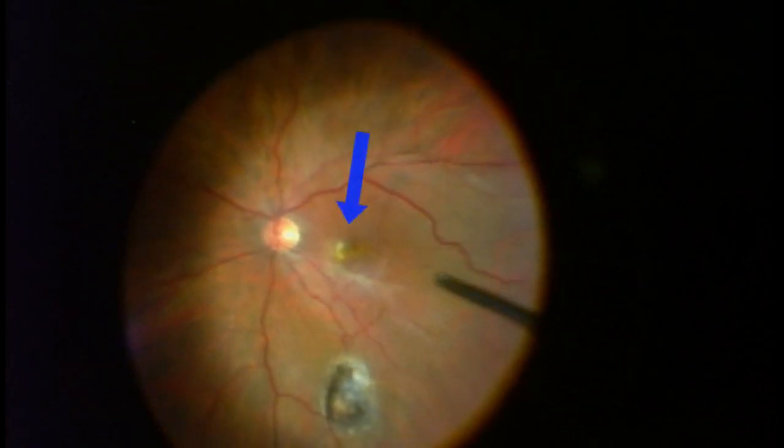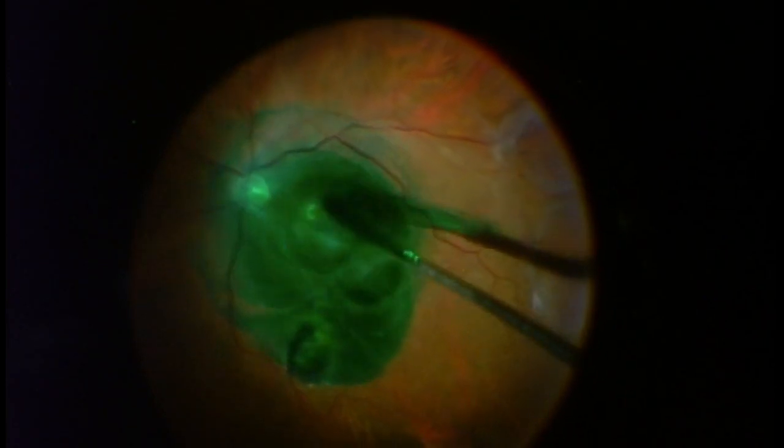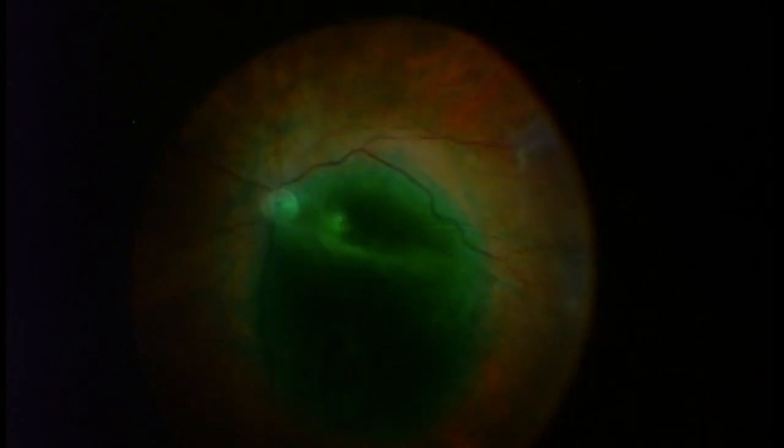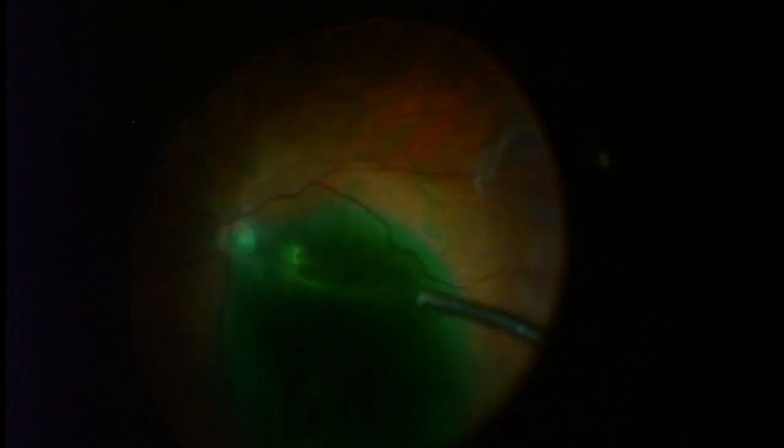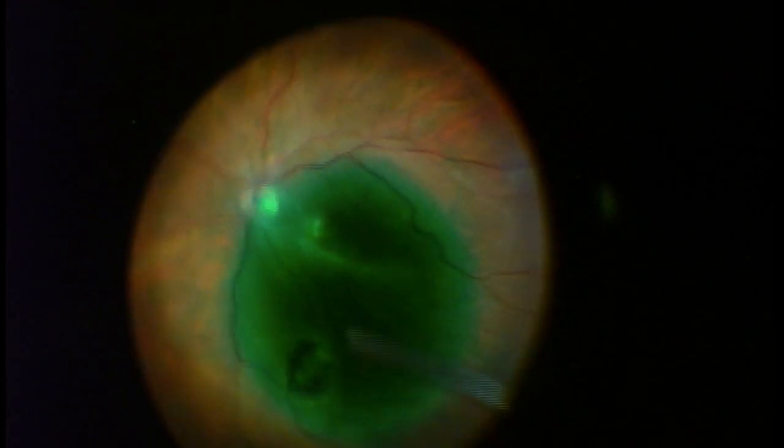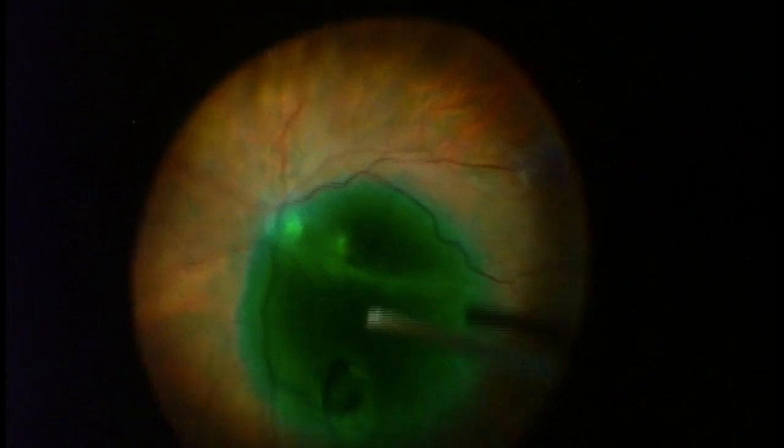The macula is that area which I'm covering with this green dye. The green dye is ICG dye. As we'll see in just a minute, it's going to stain a good portion of the epiretinal membrane so I can see exactly where I have to peel the epiretinal membrane.